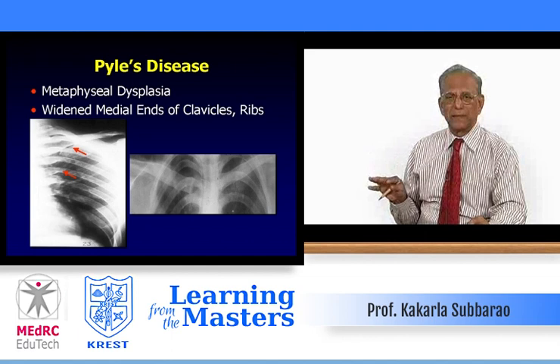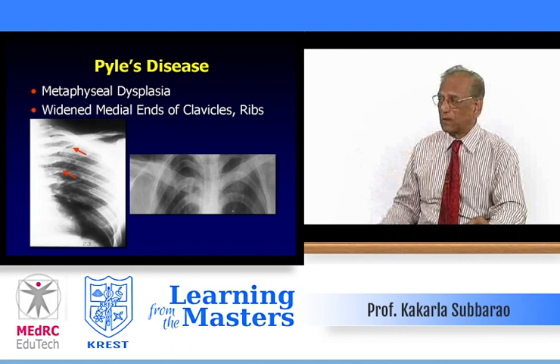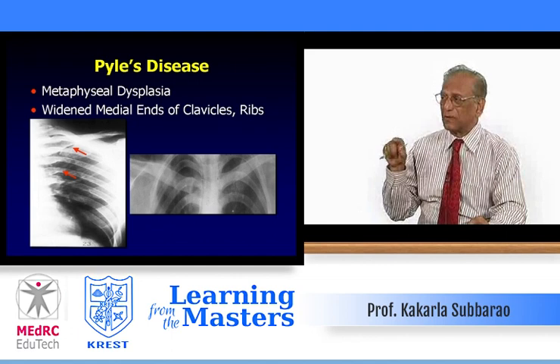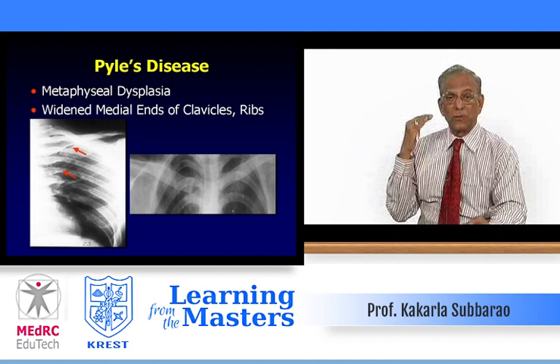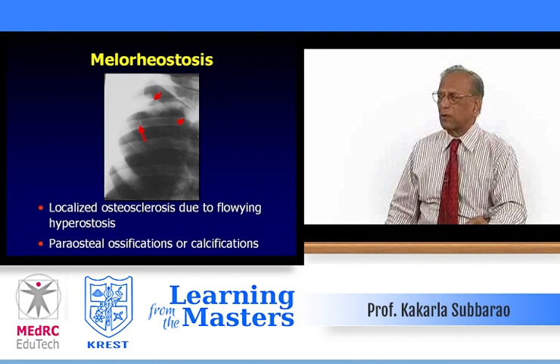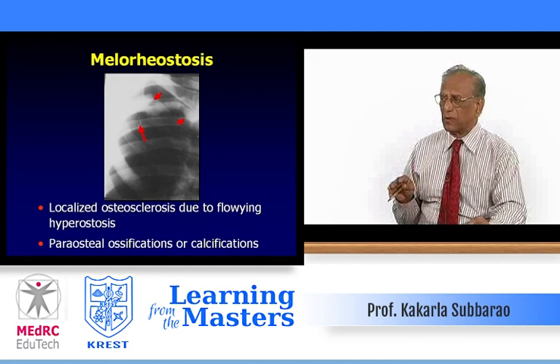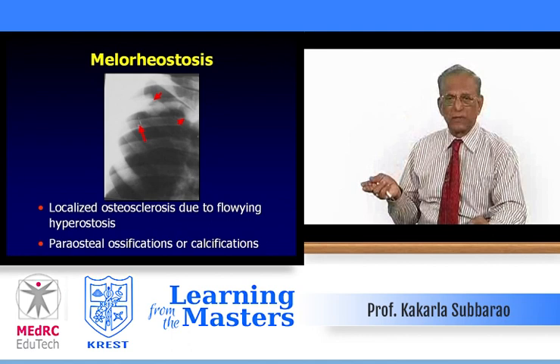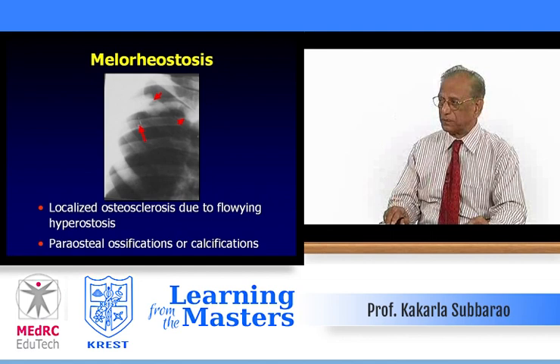Pyle's disease is rarely seen but must be considered. It is a metaphyseal dysplasia with lack of modeling of the tubular bones, particularly the metaphyseal part. Note the distended, dilated, extended posterior ends of the ribs, and wide medial ends of the clavicles and ribs — that is classical of Pyle's disease. Melorheostosis is not diffuse or generalized; it is a localized osteosclerosis due to a flowing type of hyperostosis, with possible para-osseous calcifications in the soft tissues.